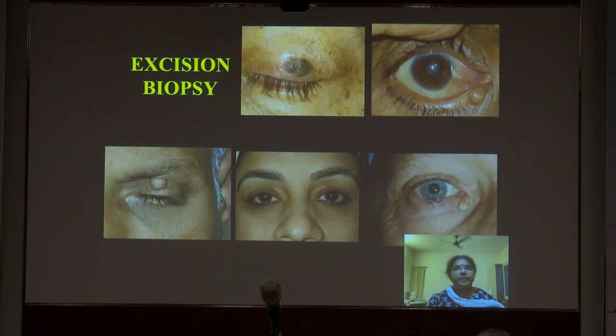Excision biopsy is needed in certain cases, because if you just waste time doing an incisional biopsy, and it's a very tiny lesion, then it may not be conclusive. So where you know for sure that the lesion has to go, especially if it is disturbing the patient cosmetically as well, it's better to remove the entire lesion. That is what we call excision biopsy.